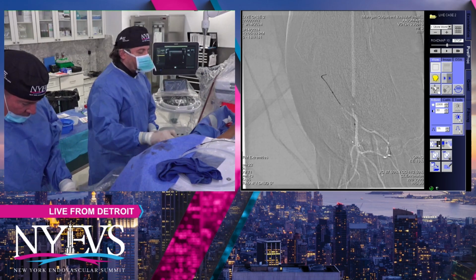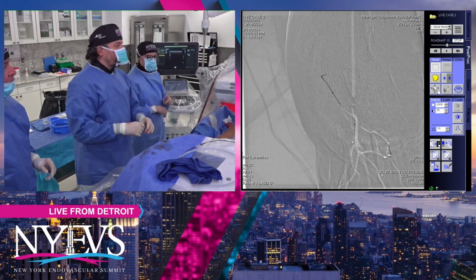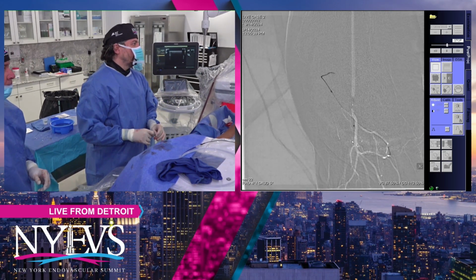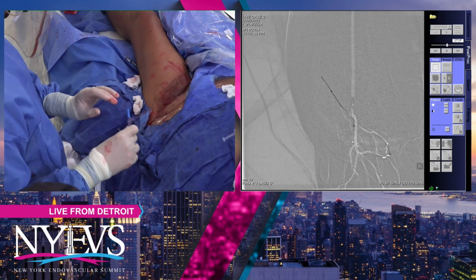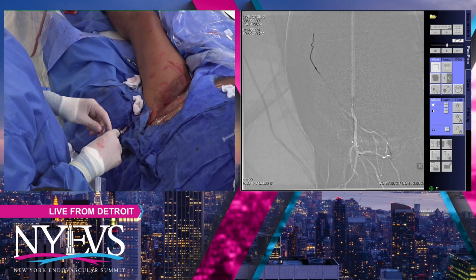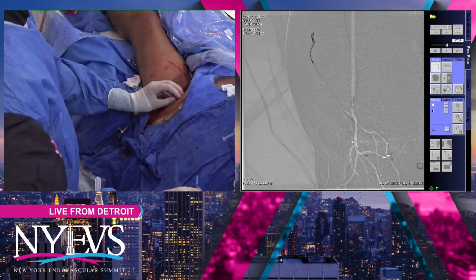Now, keep in mind that these are all registries and not randomized trials per se. Indirect or incomplete pedal loop is in line with the indirect angiosome process, estimated at around 60 to 65%. So I'm trying here to basically go all the way to where the heel is to complete the pedal loop.